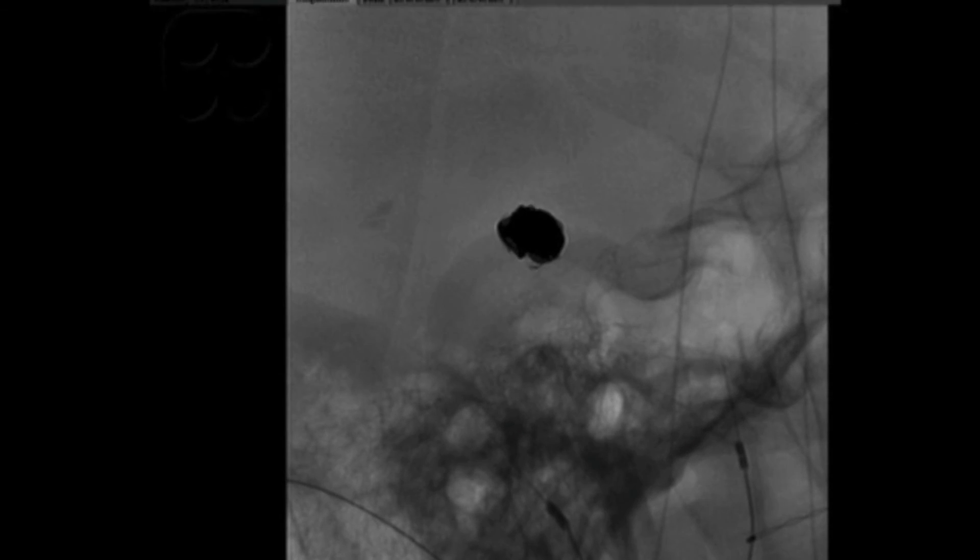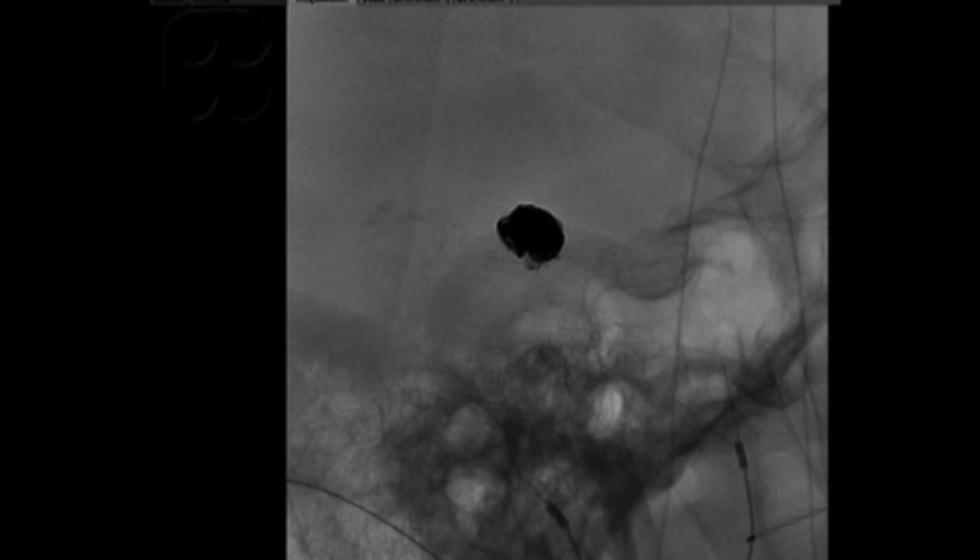Finally, on this sagittal view, once the coil embolization is completed and the balloon catheter is deflated, the tail of this coil is unstable — waving and protruding into the basilar artery. When contrast is injected, you can see that the tail of the coil protrudes and waves with every injection. At this point, it was considered a potential risk for thromboembolic phenomenon, especially with a bioactive coil.